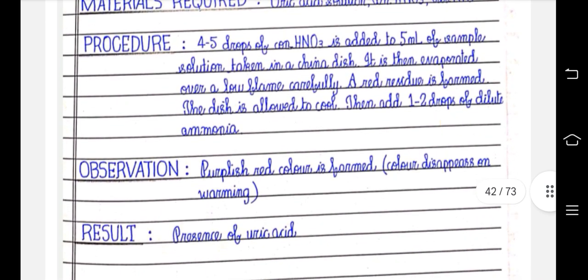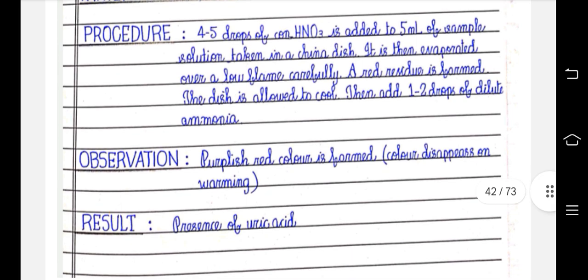4 to 5 drops of concentrated HNO3 is added to 5 ml of sample solution taken in a china dish. It is then evaporated over a low flame carefully. A red residue is formed. The dish is allowed to cool and then add 1 to 2 drops of dilute ammonia. Purplish red color is formed. Color disappears on warming. Presence of uric acid. Concentrated HNO3 is added. Heating. Evaporate. That's it.